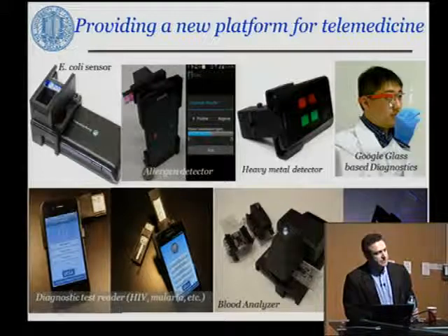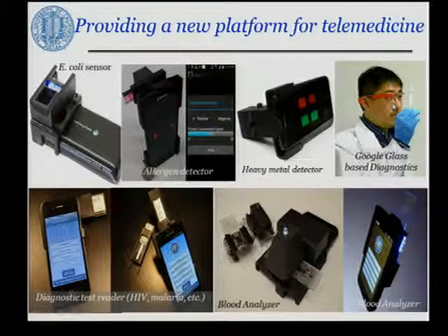Recently, there are also other types of devices that everybody's very excited about, including wearable computers like smartwatches and, for example, wearable glasses, as shown here with Google Glass. We've also been working on converting those kinds of interfaces to measurement technologies. In this case, you're looking at a lateral flow diagnostic test reader, which captures images in a voice-activated hands-free interface, and everything in terms of computation and understanding the quantification of the test strip color change in response to an analyte is done off the server after some machine learning.